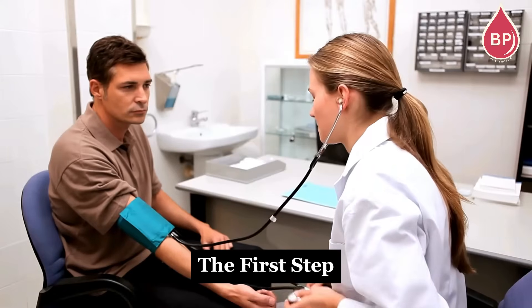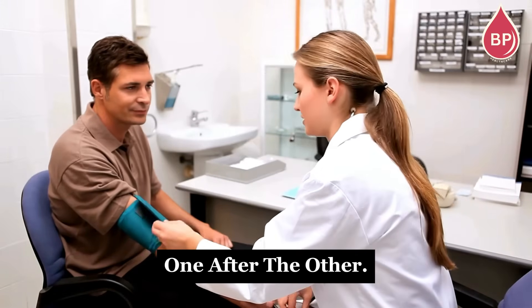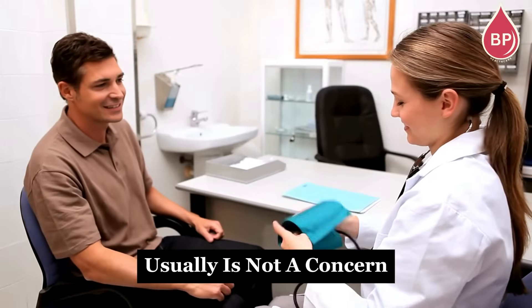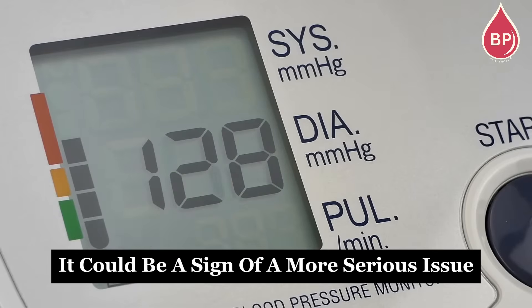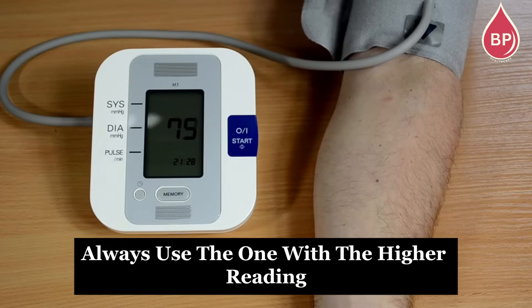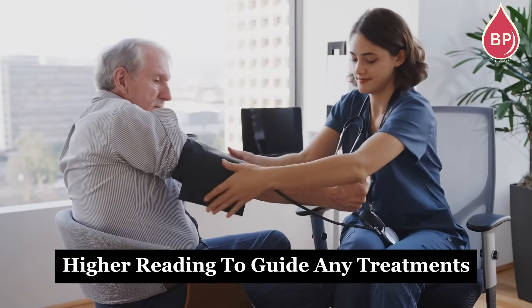If you're a new patient, the first step is to measure your blood pressure in both arms, one after the other. A slight difference between readings is normal — up to 5 mm of mercury usually isn't a concern. But if the difference is more than 10 mm of mercury, it could be a sign of a more serious issue. Once you've checked both arms, always use the one with the higher reading for future measurements. Doctors also rely on the higher reading to guide any treatments.